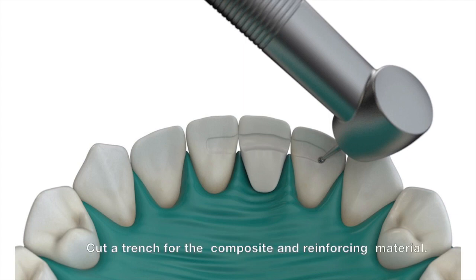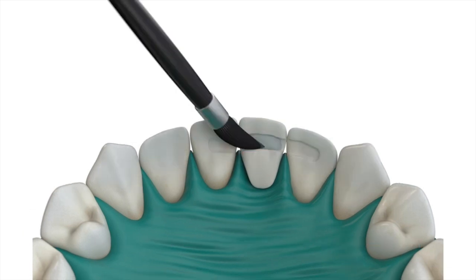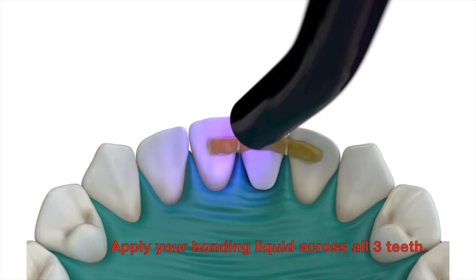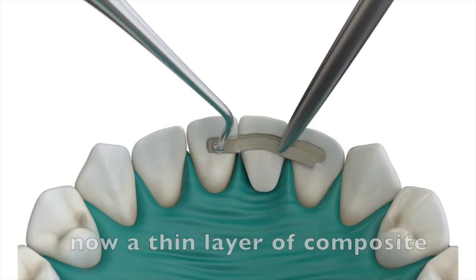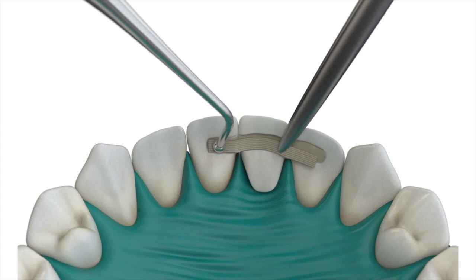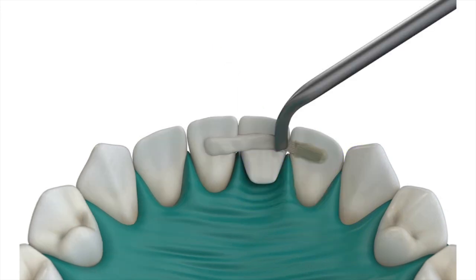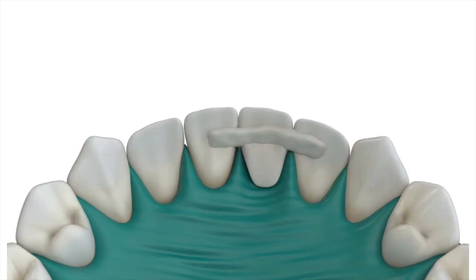Now the denture tooth is securely placed. Use a fissure burr or any common burr to place a trench on the lingual surface. Treat the enamel with acid etch, then take a little bit of the monomer used before to prep the denture tooth. Rinse and dry your prepared surface, then apply the unfilled resin again across all three teeth and light cure for 10 to 20 seconds. Place another layer of composite into the prepared area, then layer in some composite reinforced fiber material on top of the resin. Light cure that for the manufacturer's recommended time. Place another layer of composite on top, and take a few extra seconds to sculpt the area before light curing — that will make your polishing and cleanup a lot easier.